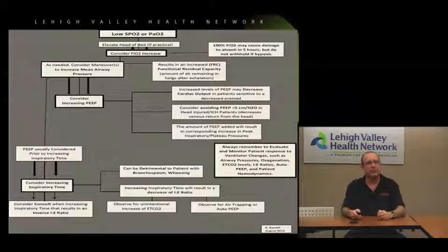But when you're thinking of increasing your oxygenation to the patient, those patients that are below 90, you've increased your FiO2 to 100%, and you just can't seem to raise your oxygen saturation, and you're really starting to pull your hair out, maybe following this guide might give you a little insight which way to go.